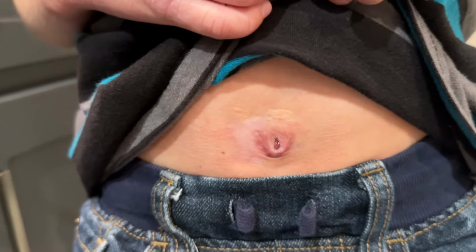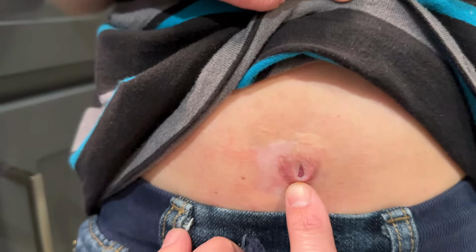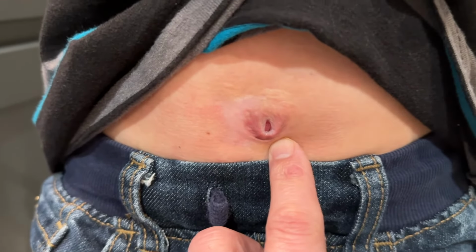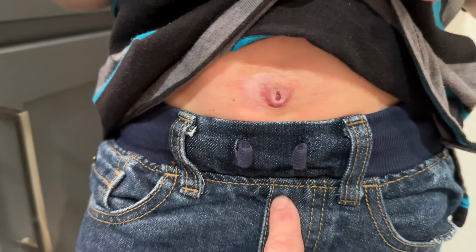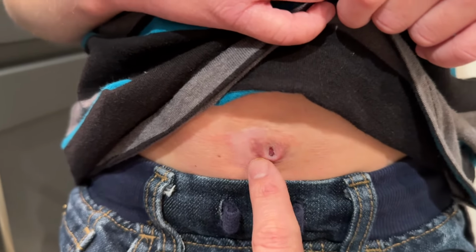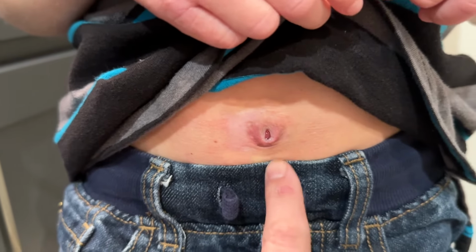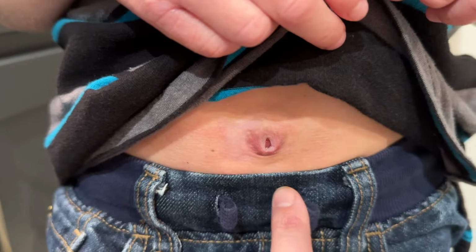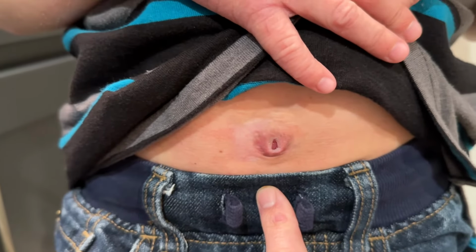So don't let the belief that this can limit you in any way get in the way, because it's just not true. And so Austin was fortunate enough at his age to be able to stretch the bladder up to his belly button. Some of the challenges, if you're a bit older, say a preteen or teenager or beyond, if you're really tall, my understanding is that it's harder to get the bladder up actually to the belly button, to use that as the entry point for the stoma. So if that's the case, if you happen to be a little bit older, it might be down here on your belt line. So you'll have your belly button, whatever that is, and then you'll have your stoma right here along your belt line. But either way, which is actually fine, because you can hide it, like I said, swimming or things like that.